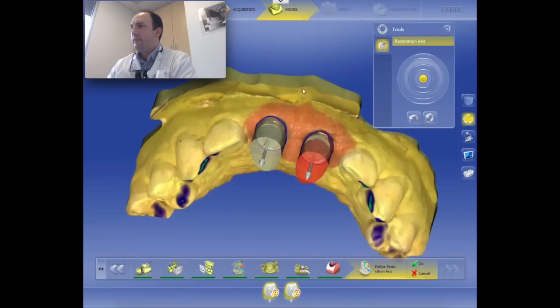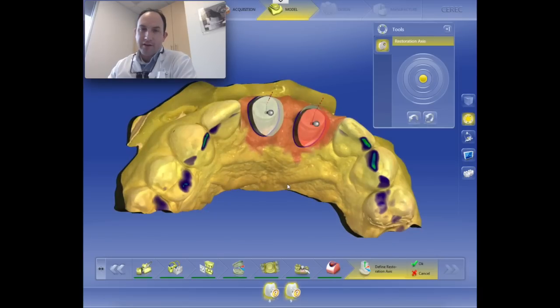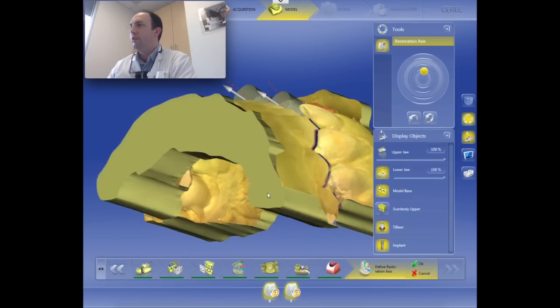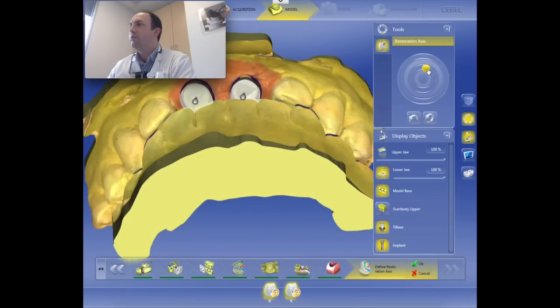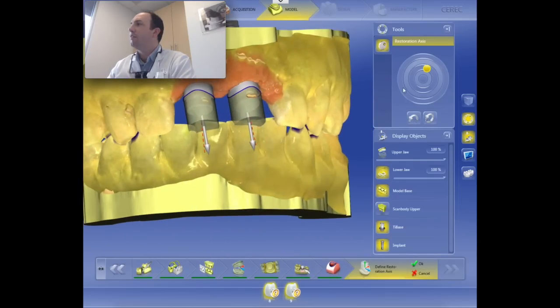All right, defining restoration axis. So this is where we will determine exactly the axis of the tooth, ignoring the axis of the implant. Now you can see this one's red right here because the line of the path of insertion of the implant screw is actually coming out the facial of that tooth. So using this little joystick, I'm going to lean these forward, and it also helps sometimes to turn on the lower arch so you can see where those teeth should be. So this is, again, determining path of insertion. You notice that both of these teeth are locked together, which is nice when we're doing multiple restorations adjacent to each other. Let me go just a little bit more to the facial. That's pretty good. I don't want them to have buck teeth. Let me pull them back just a little bit lingually.